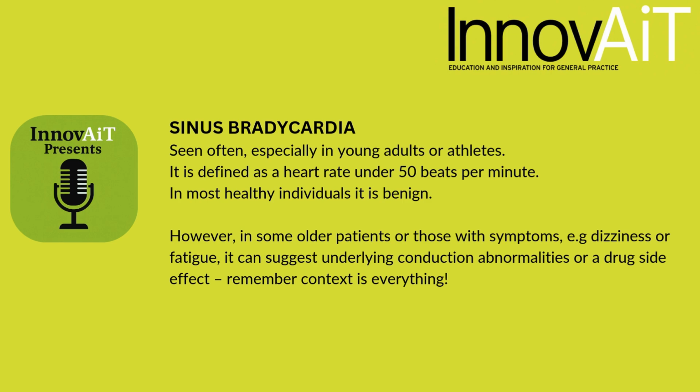So starting with sinus bradycardia, you will see it often, especially in young adults or athletes, defined as a heart rate under 50 beats per minute. Now, in most healthy individuals, it's benign. But in some older patients or those having symptoms such as dizziness, fatigue, it could point to underlying conduction abnormalities or a drug side effect. Remember, context is vital. Next is heart block.